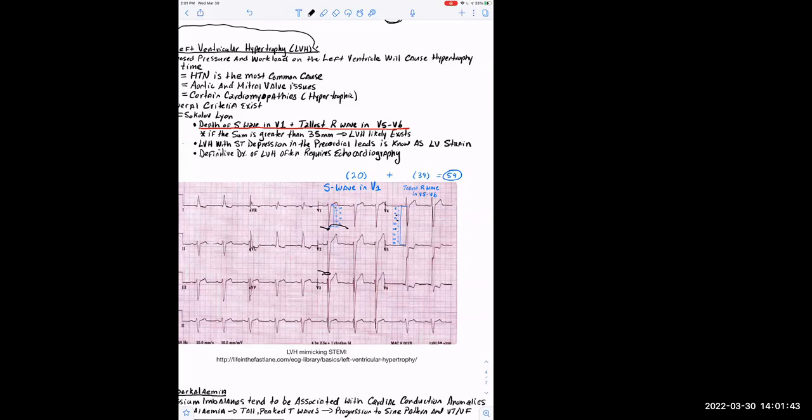Absolutely. That's T-wave discordance. That means the T-wave and the QRS are pointing in different directions. So let's take a look at V1, V2, and V3, which are our right precordial leads. Do we see T-wave discordance? Yes, we do, because if you look at V1, note that your QRS is pointing downward, and your T-wave is pointing upward, or to use more appropriate terms, your T-wave has a positive deflection, and your QRS has a negative deflection. Okay, so that is what's called T-wave discordance.